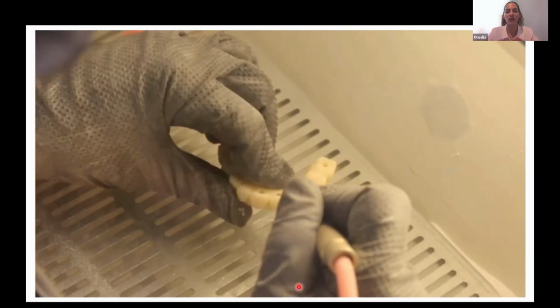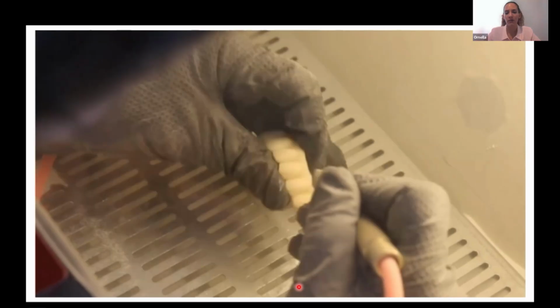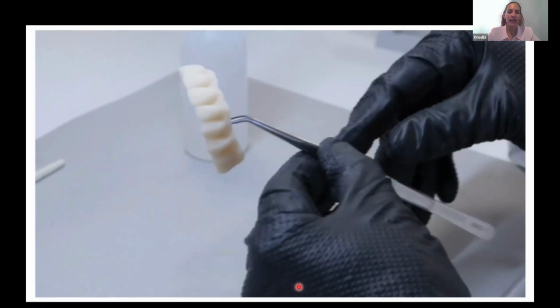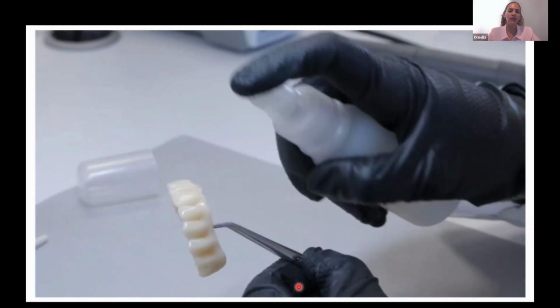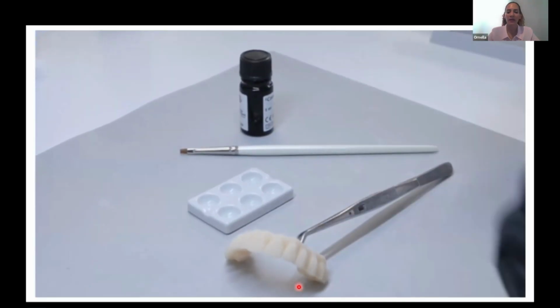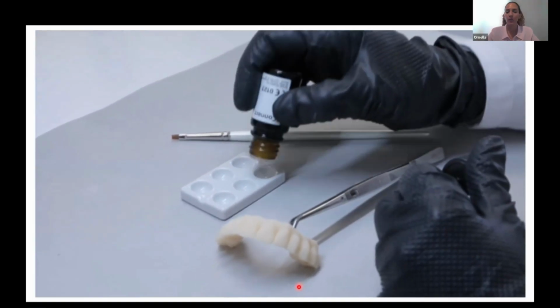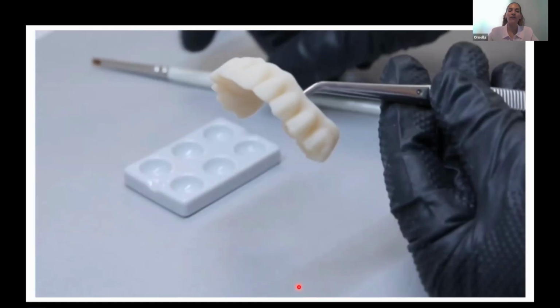I put the green a little, and start doing the sandblast with aluminum oxide, 110 microns, 2-3 bars of pressure, okay? After this, please don't clean with water, okay, or water steamer, always with alcohol, okay? The alcohol is going to help us to eliminate the grease, it's going to help us to eliminate the superficial tension of the material, and also it's going to evaporate completely.